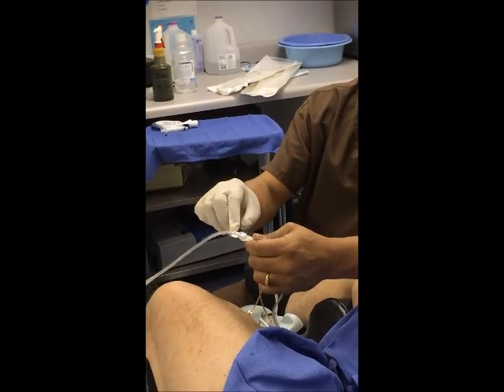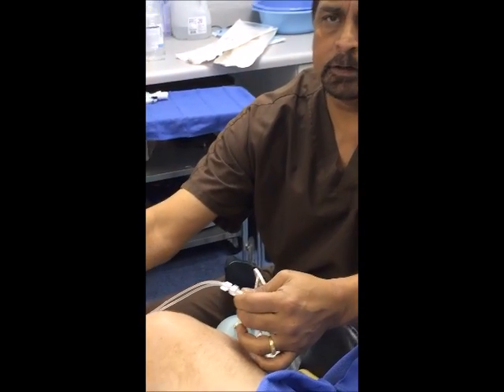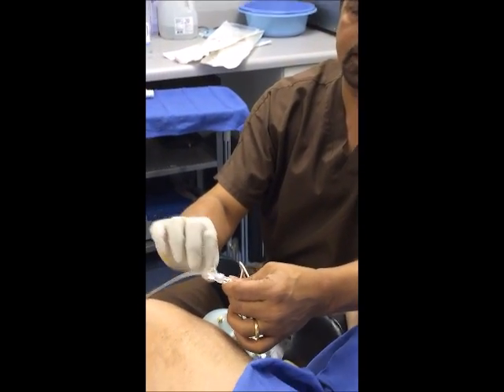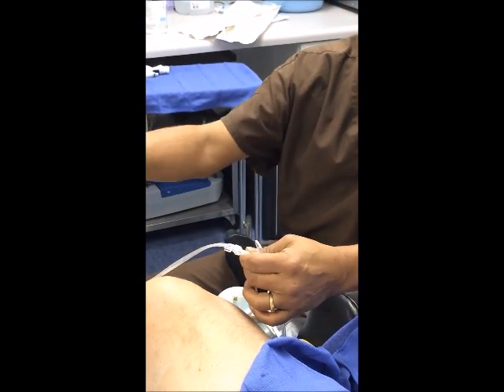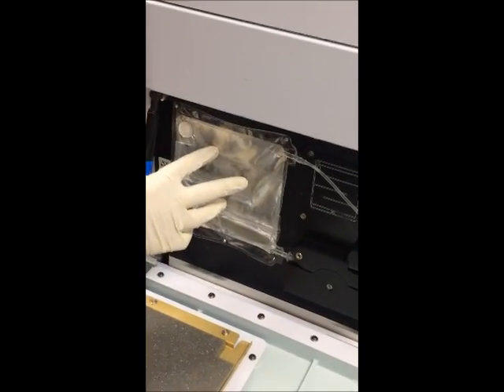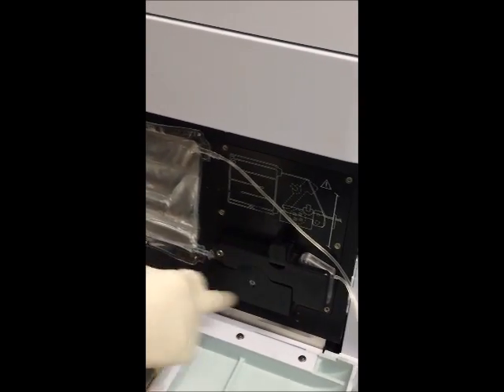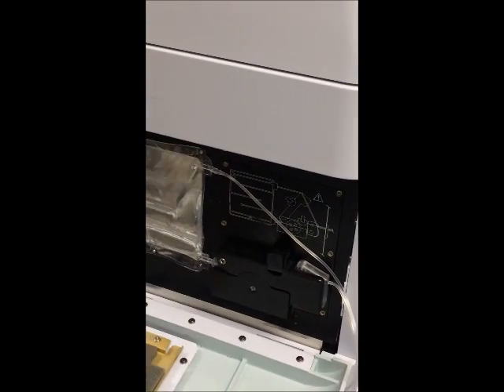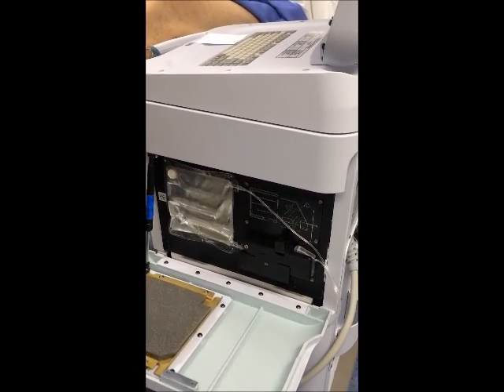While connecting, my assistant put the cooling in and out tubing. There is a refrigerator unit here. Constantly while we are heating the prostate, the urethra is kept cooled by running chilled water. This is a disposable bag — we put 100cc of water saline in there with a pump. One tubing goes through the pump and the other is the return tubing. This is how we circulate the water, and the refrigerator unit refrigerates the water to a certain temperature.